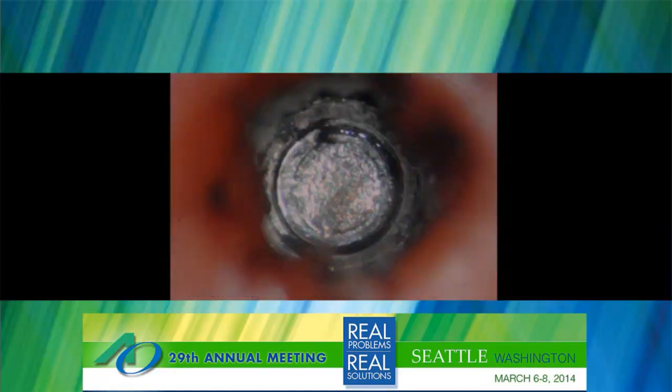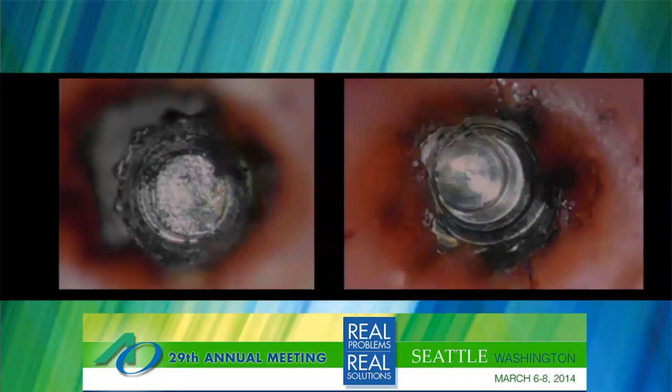So the next image, I'm up here almost at 12 o'clock, and it just came quickly up to that point. And why was that? Because that leading sharp edge now exited the implant threads, and now we've taken it from a 3 to a 1, and it's easy. So this case was totally retrieved without any other instruments other than an endodontic explorer and a little bit of oil of wintergreen. And that's just having the visualization to know what's going on.